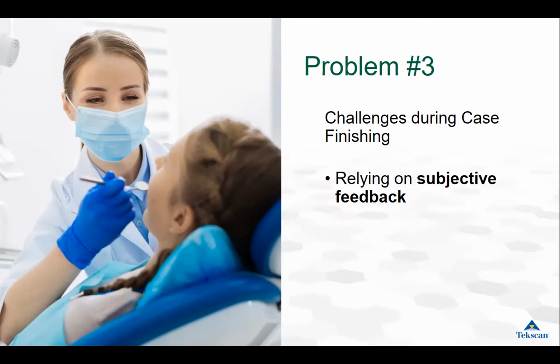Chasing the bite without digital occlusion data is time-consuming for you as the dentist, frustrating for the patient, and non-productive for your practice. Often, using a tool to help you measure the bite makes you do less corrections and less adjustments. Finishing your cases to a higher level actually helps prevent problem number two, where patients are returning with problems.